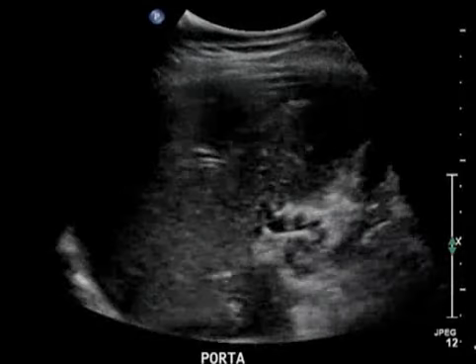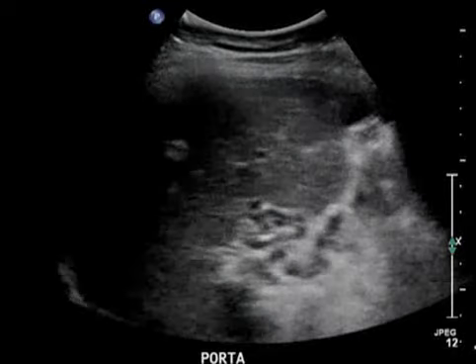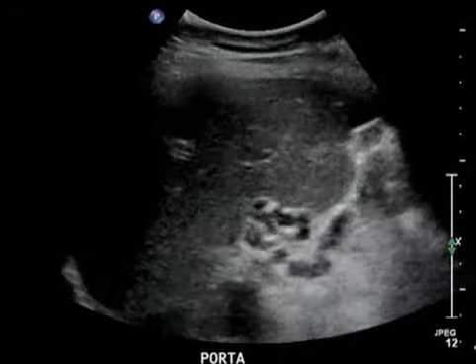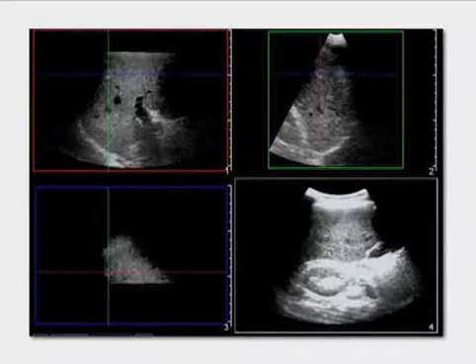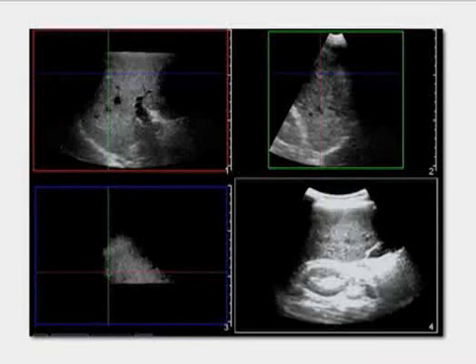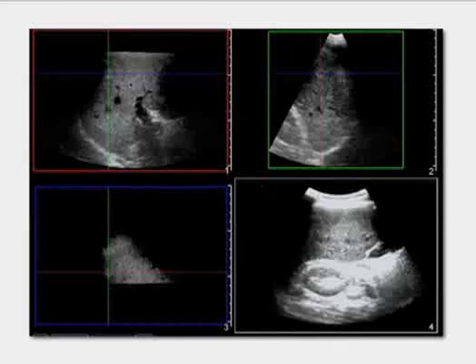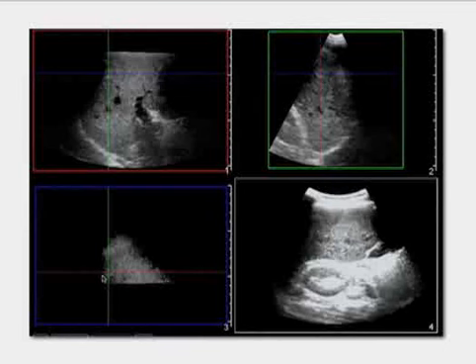So how does this apply to ultrasound? Unlike CT where we typically acquire in the axial plane and then reconstruct in other planes, in ultrasound we're used to moving the transducer into any plane we want. However, it's not always possible to acquire every plane we want with ultrasound, and that's where multi-planar reformatting comes in. This ultrasound example is similar to the co-location I showed on CT — the crosshairs in each image are pointing to this small echogenic structure. There it is in the coronal plane, which was impossible to acquire directly, and we can see it in all three planes.